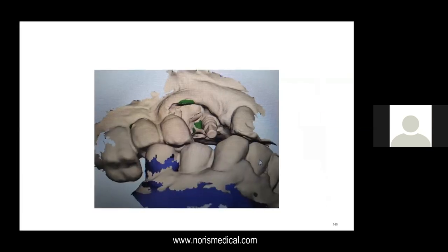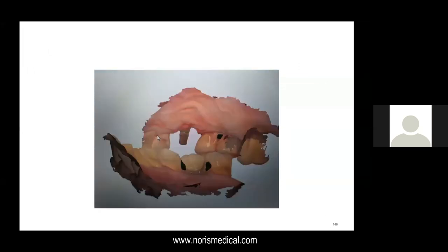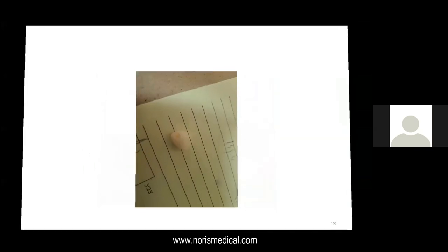After all, a very nice scan, because you can understand that the implant is located in the palatal part, in the palatal aspect of the socket. So don't be surprised if the buccal to the implant is all empty, of course. Usually I put the bone after the scanning. It reflects less, and this is more comfortable for me. This is how it looks.